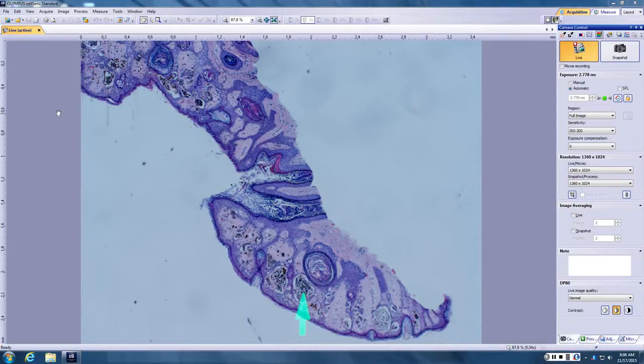The ones you get on ear, scalp, breast, genitalia, Macarena sites. Some people have said any site you can pierce has this pattern of nevus, so whatever helps you remember the sites that get it.